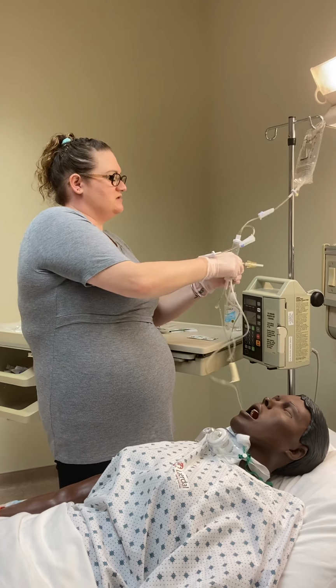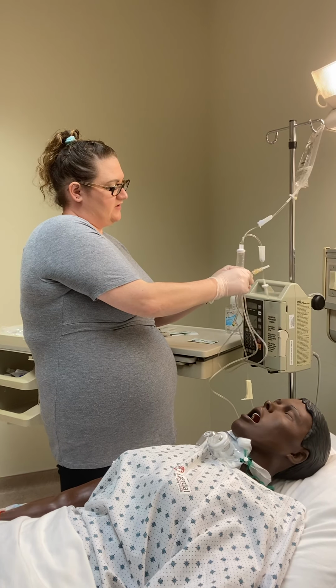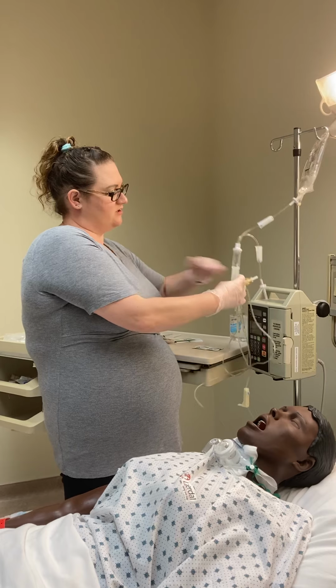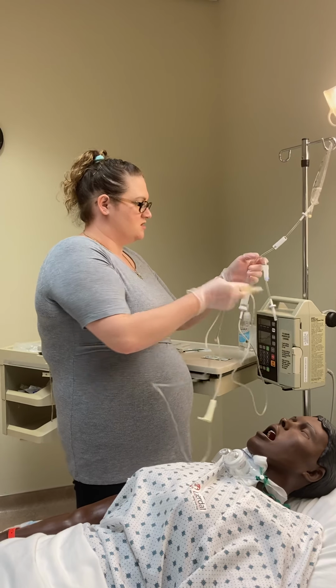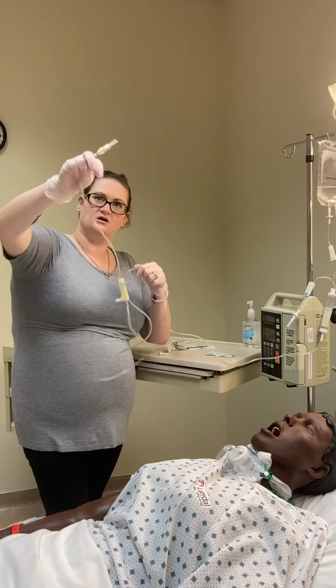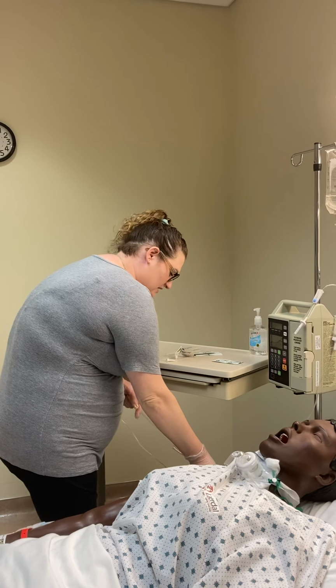And I am going to squeeze because I want to fill the filter up to the top of the filter. Sometimes you have to, you know, chop it a little bit to get it to fully cover. All right. And then I'm going to slowly prime all the way through to the end of my alligator clamp.